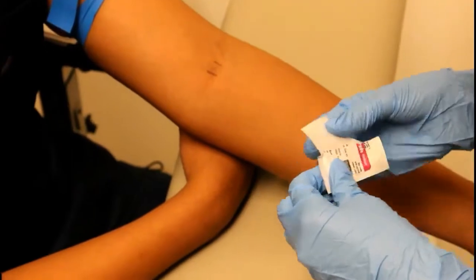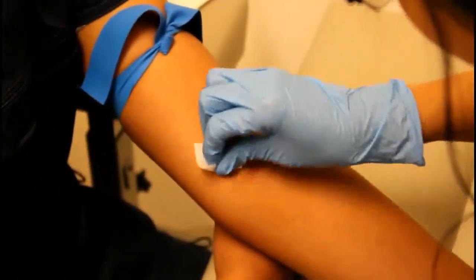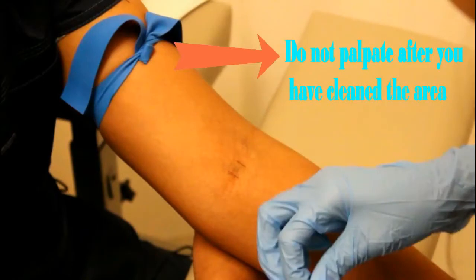Then cleanse the area with an alcohol pad in a circling outward motion. Once you have cleansed the area, you cannot palpate again. Do not blow or fan to dry the area due to contamination. Wait for it to dry on its own.